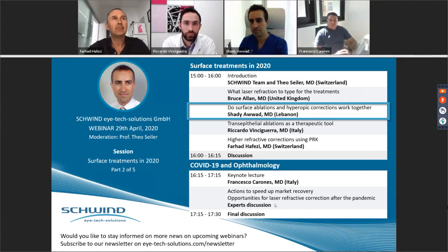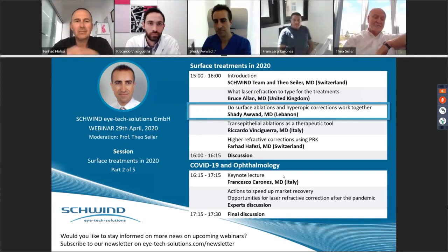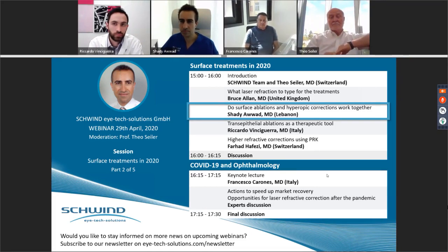Well, I think you know it. In the Amaris system, the transition zone is automatically calculated by the algorithm. It seems to be also the case for the newer generations of lasers, so we are no longer unique there. I agree with you. We discussed this in the past, that particularly for hyperopia, the larger the transition zone, the gentler the progression towards the periphery, the better the control of the corneal curvature gradient, and likely the better the response in the mid to long term.